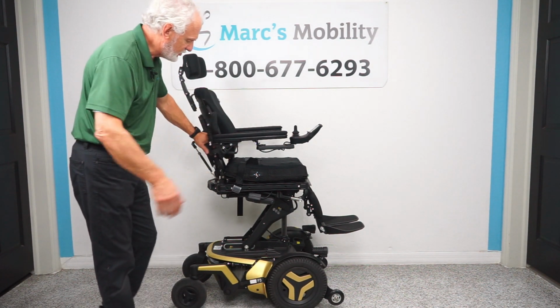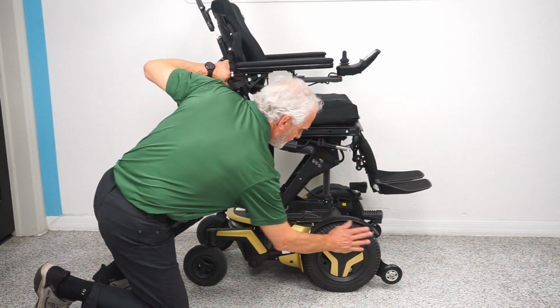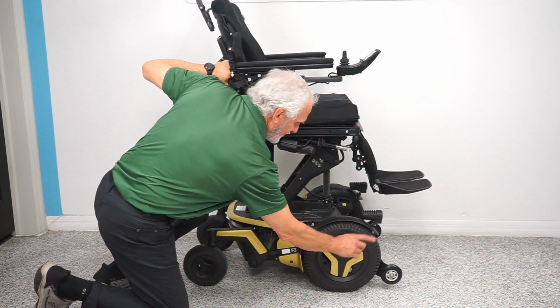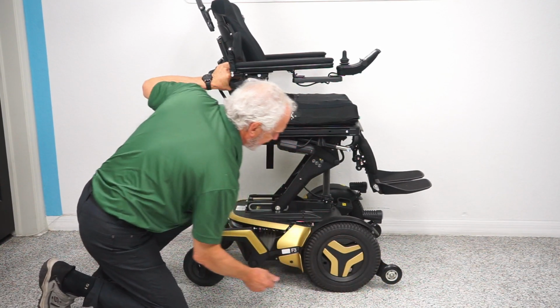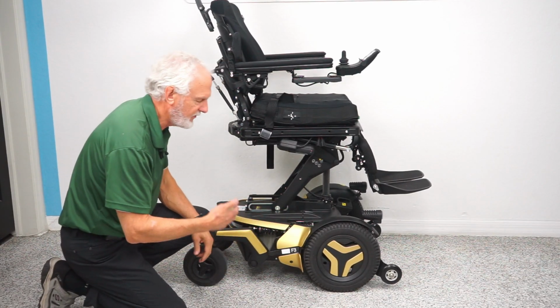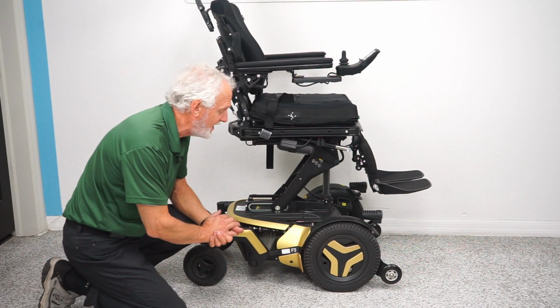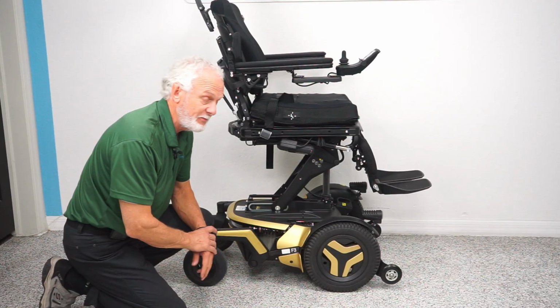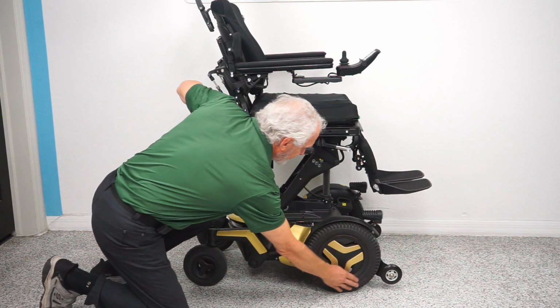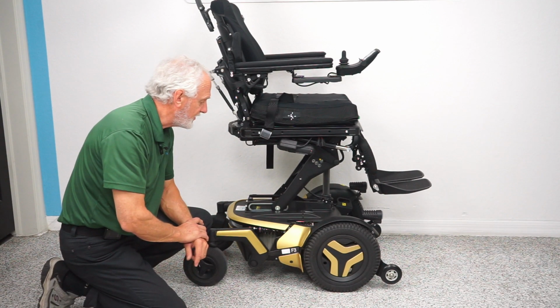Before we do anything else, let me show you the base on this chair. This is considered a front wheel drive. What that means is your drive wheel is up front and there's no wheel on the ground in front. This is off the ground. It's just a tip wheel right there. This is called a front wheel drive. It's very good for inside. And it's also very good if you're going to go outside in the grass because all the weight of the chair, and this chair weighs about 425 pounds, is transferred here to the bottom of the wheel. So it gives you good traction if you're in the yard, okay?